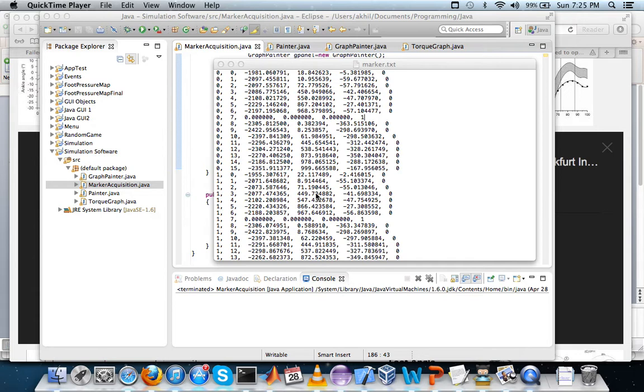In this video, I'm going to be talking about my work with Project 1, which is using inverse kinematics for gait analysis. I'm going to begin by showing you the data that comes in using multi-camera reconstruction, by which we estimate the position of the patient's legs. Here you have the text graph that these cameras generate.